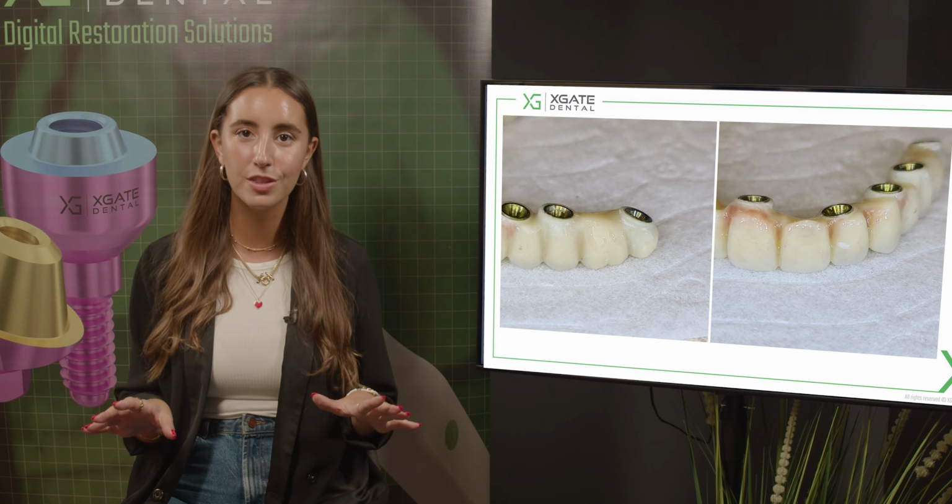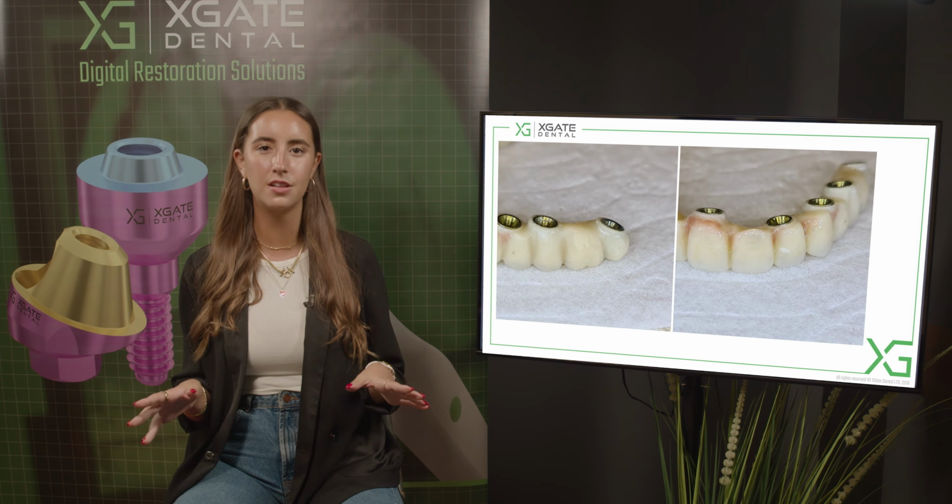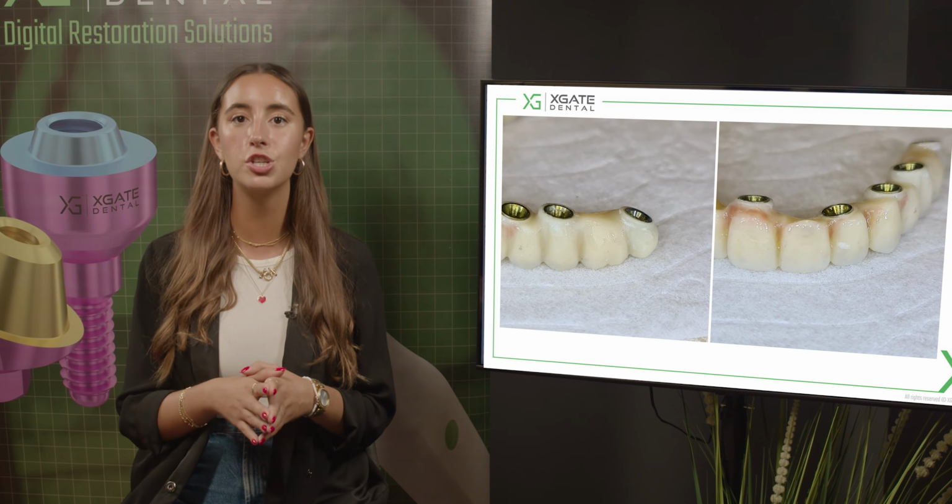Closed all the gaps with composite material. So when you're making a full zirconia bridge, for the parts that close with the gingiva, it's better not to glaze, because this way you minimize the retention of plaque. The part that closes the gingiva for the upper bridge is the top part.